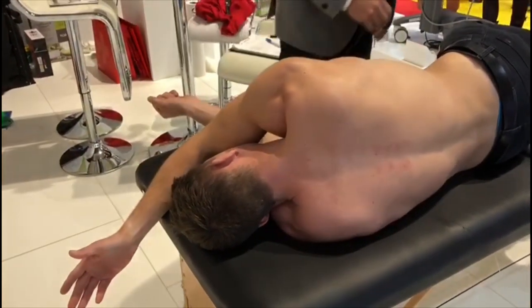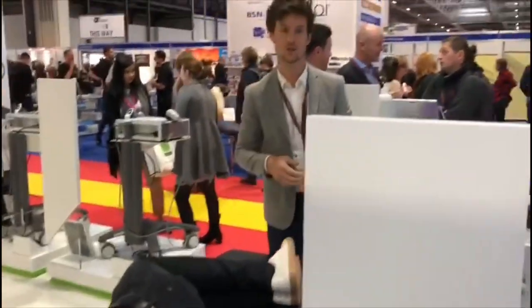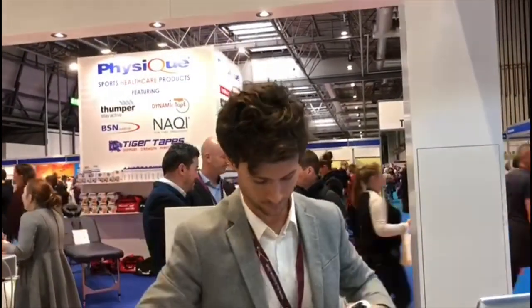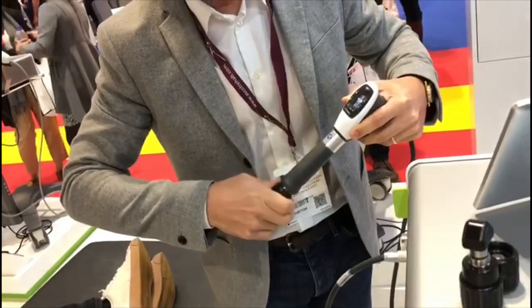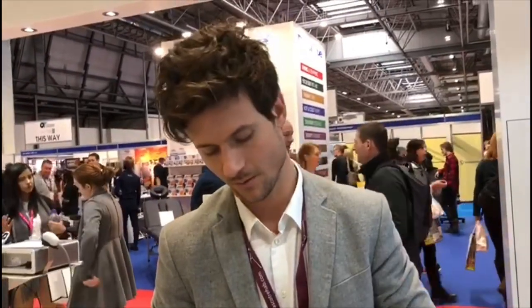All right. So now I put the fascia in a semi-tensed way. It shouldn't be actively tensed. It should be in a stretched way like this. That would be better results for the fascia, I think. Now we use the knuckle disc applicator, which is my favorite for fascia treatments.